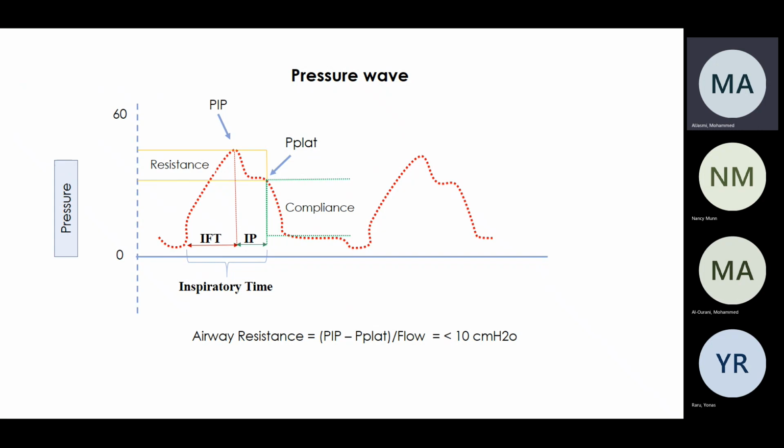Just the flow, you mean the FiO2? You mean the inspiratory flow? The new machine, we don't have the inspiratory flow. When you open it, there is flow, but you cannot change it in each mechanical ventilation. How can you change the flow?